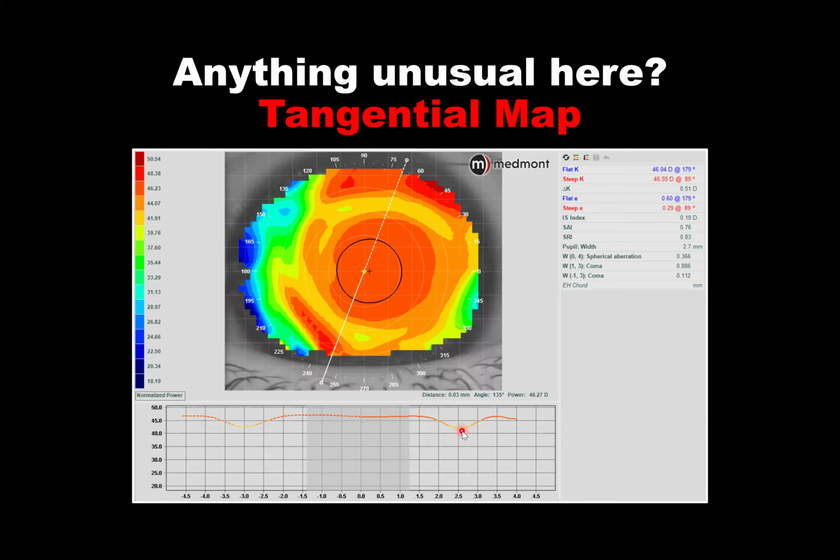Entonces, vemos, esto es un paciente, quería hacer ortoca, hacemos los mapas, nos damos cuenta del moldeo que existe y obviamente un paciente con moldeo corneal, pues no podríamos empezar a trabajar ortoca hasta que esa córnea no llegue a su estado natural, o sea, que no esté moldeada por un lente de contacto.